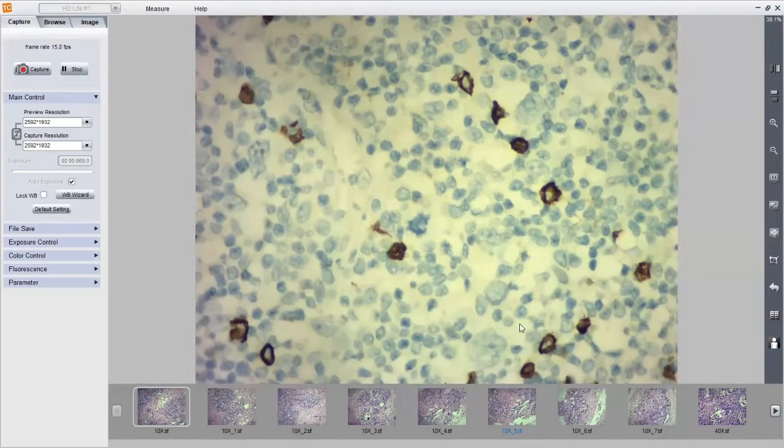There are cases where you will get CD20 positive Hodgkin cells. But in those cases, most of the time, the CD20 intensity would not be as strong as the background B cells. It will be a little bit dimmer. And when you put other B cell markers like CD79 alpha or OCT, BOB1, they would usually be negative. So CD20 in this case is negative.